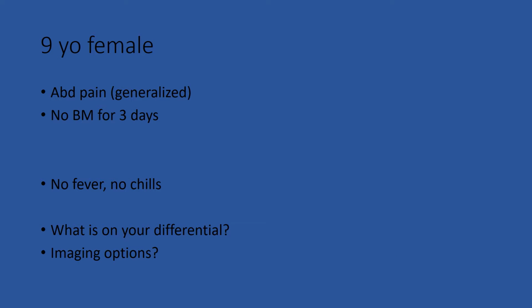So another situation in which you might not necessarily think of imaging, but here's an option for you. Got a 9-year-old girl. She comes in. She's got some belly pain. Hasn't moved her bowels in what she says is 3 days.